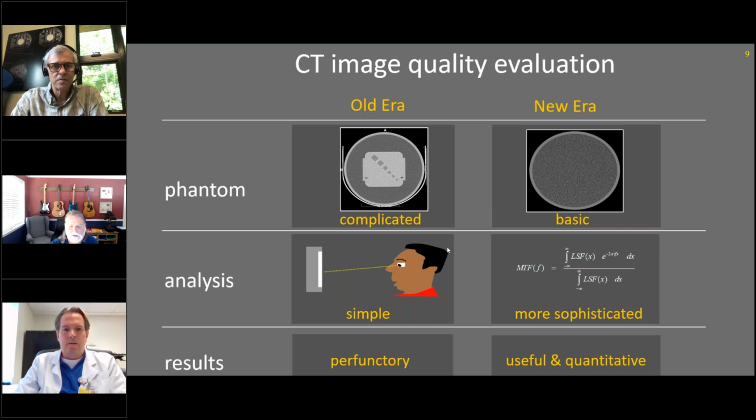Well, that's a good question, and the answer sort of differs if you're talking about dose or image quality. For dose, the state sort of requires for CT that you measure, at least the state I'm in, and this is true for many others, the CTDIvol as it's called, the computed tomography dose index, and that impacts the way that you measure it using that 32 centimeter diameter phantom.